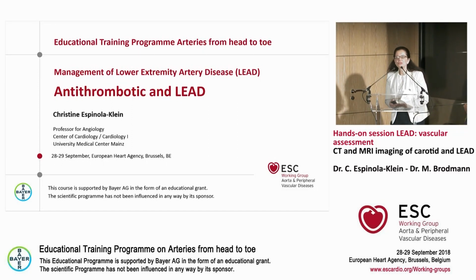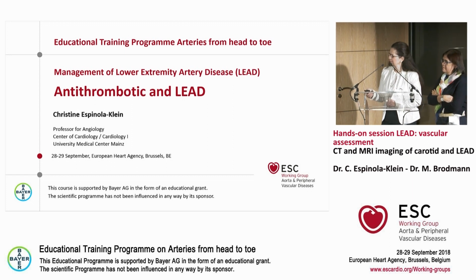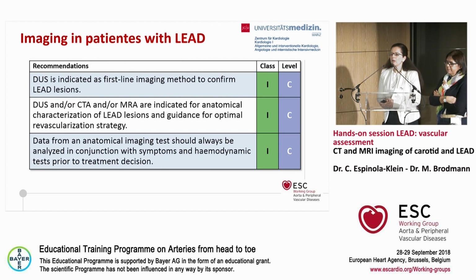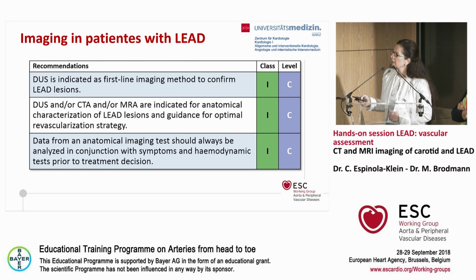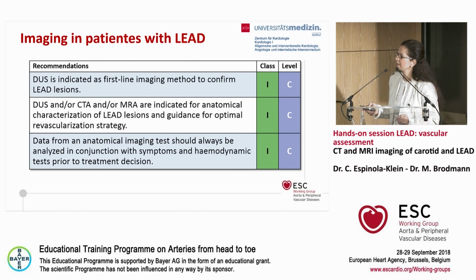So we will move to the lower extremities. Okay. Good. What are the recommendations to do something in addition to Doppler ultrasound? Of course, Doppler ultrasound is the first-line imaging method. This is a clear consensus from the guidelines.